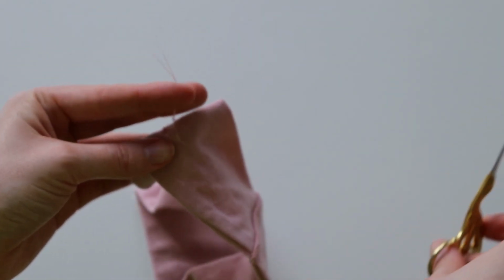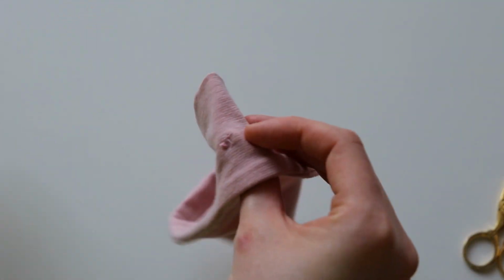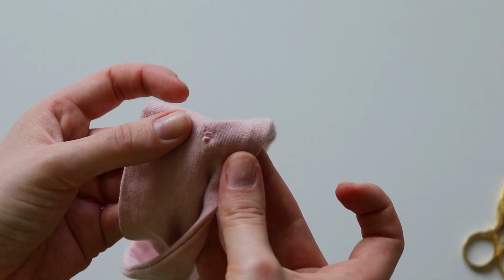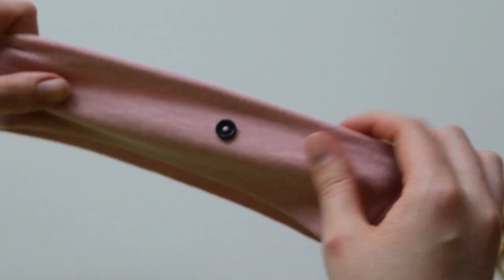So again, you can see I probably didn't need this much, but it does make the whole process just a little bit easier. So just use your judgment for whatever you have, but once you are done, on the inside, you should see there are a little couple ugly threads here because I'm not the greatest seamstress, but on the outside, it looks pretty cute.